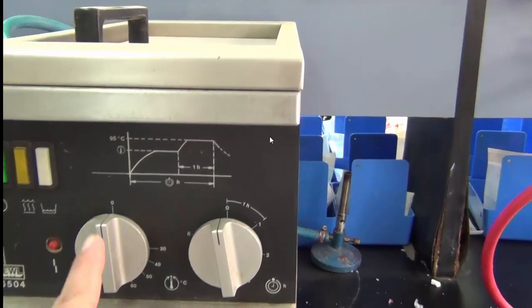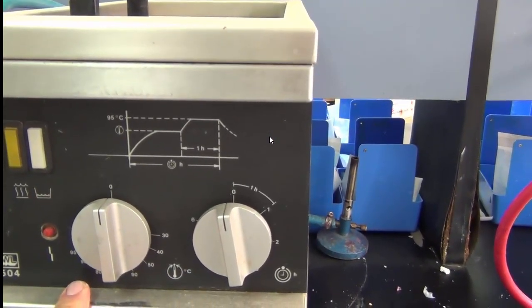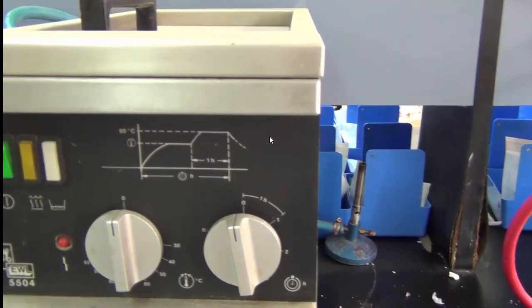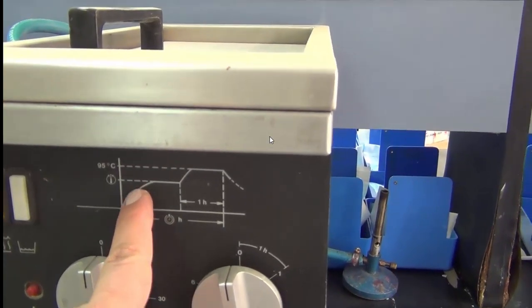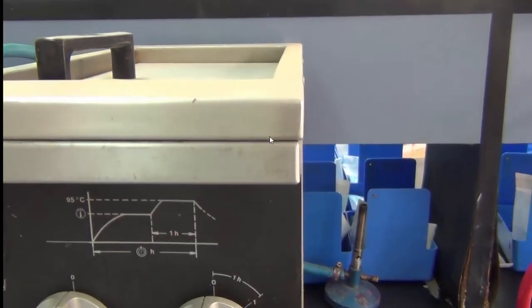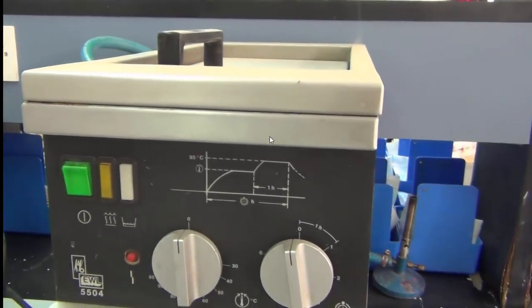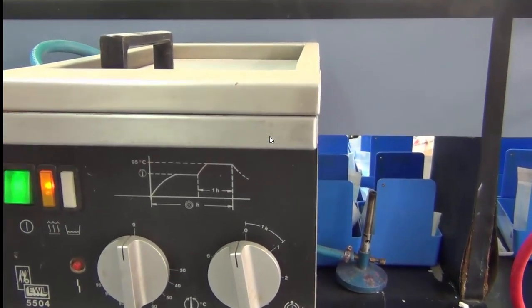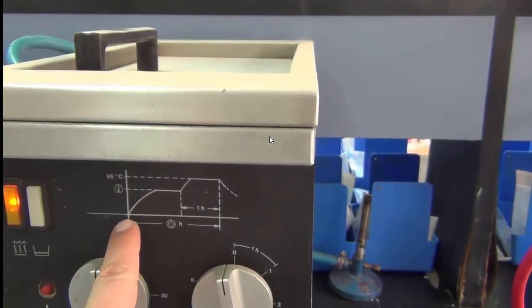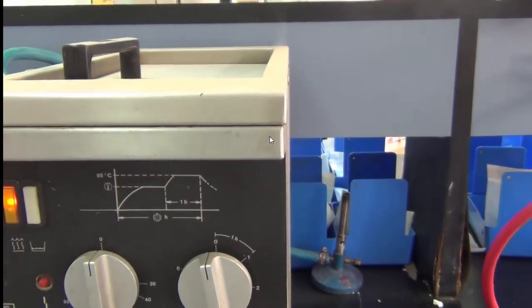But the idea is, according to the manufacturer instructions, we put the temperature of the water and we control the time we apply this temperature at, and we will find that this device can control 2 heat cycles until the fully set material. Okay, so we put it on, and once the temperature of the water reaches the first minimal, it keeps heating the water until it reaches this stage. This is when we can open it.